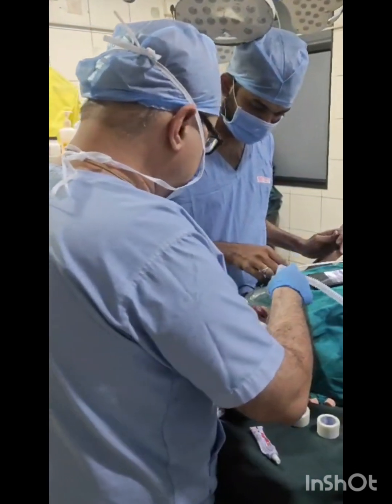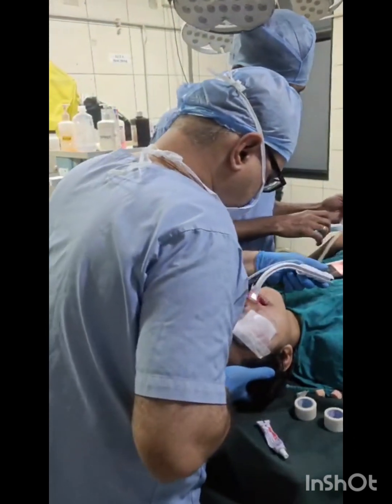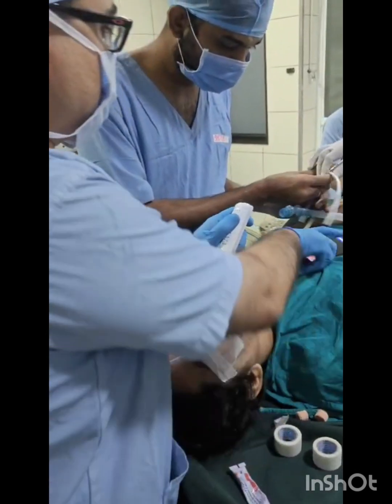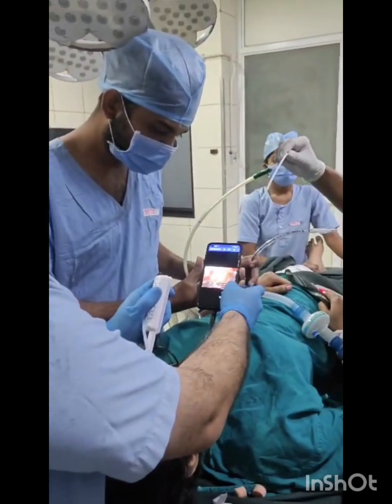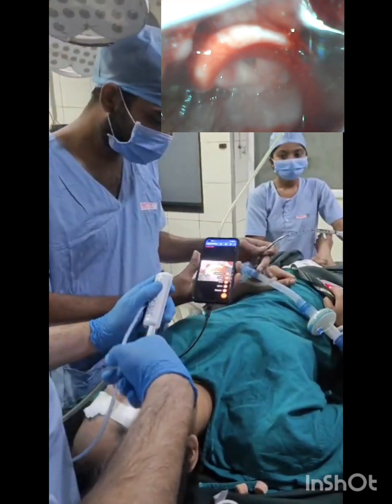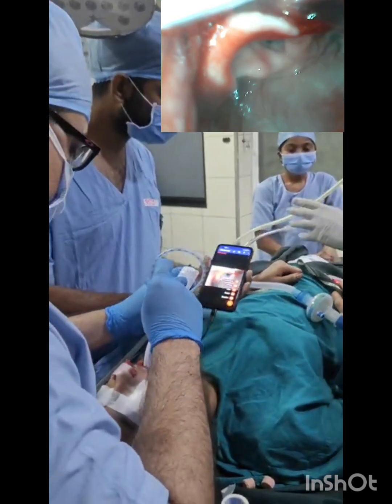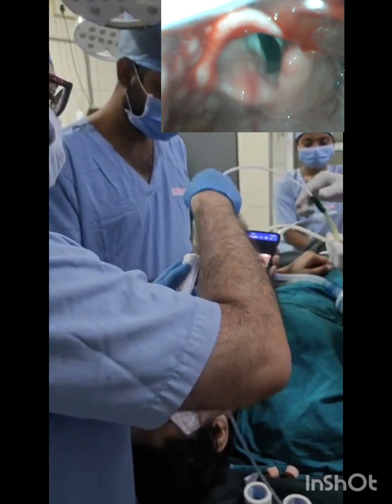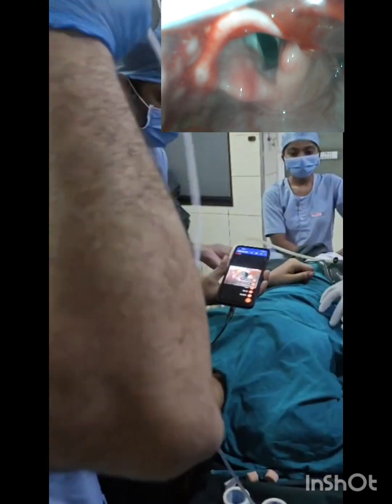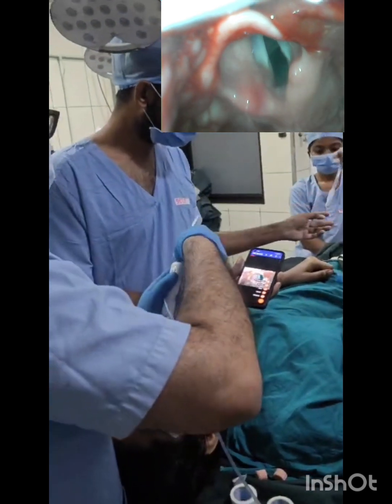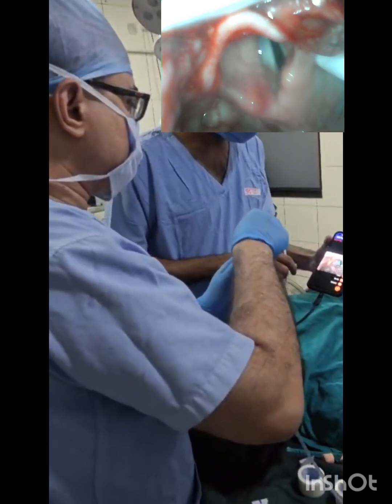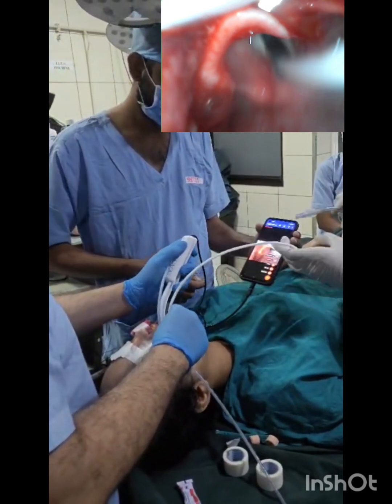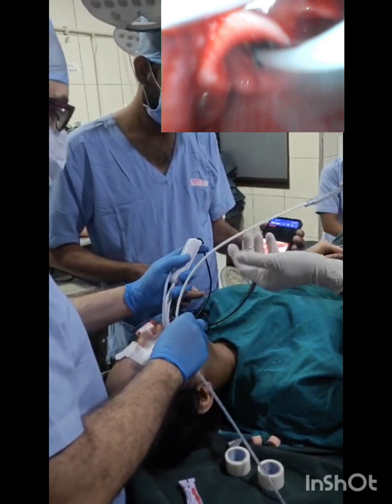We have induced conventionally and are intubating with the TASCO. See the insertion of TASCO — we can see beautifully the larynx. Now introducing the bougie inside. This is the bougie entering the larynx; it has entered, and now railroading the endotracheal tube over the bougie.